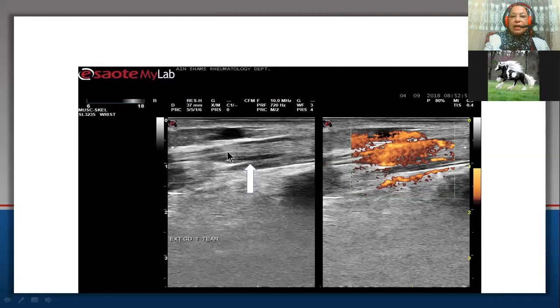On following the tendon by ultrasound till the myotendinous junction, the tendon was separated from the surrounding muscle with fluid collection around it and positive Doppler signal, which may indicate bleeding. So there is a tendon tear at the myotendinous junction. So please don't forget again to follow the tendon, even if there is apparent pathology at the rest, till its myotendinous junction proximally and till its insertion distally. Don't forget to count the slips of extensor digitorum tendon to make sure that there is no tendon tear.